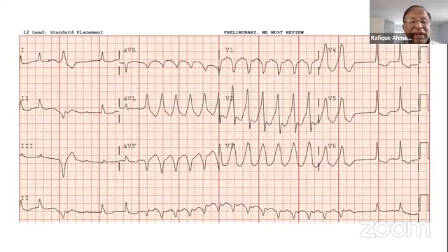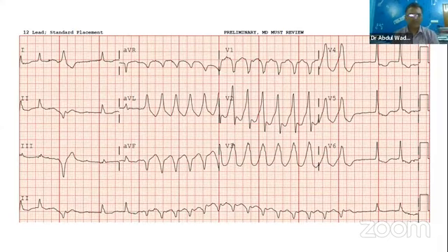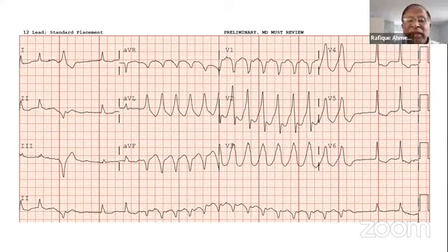The same patient, there was another ECG. Look at this. If I had just lead V3 all over the place, then I would be in trouble. I would say, wow, this looks almost like a sine wave. But even then, there are sharp points. There is a sharp tip. There is a sharp deflection on the downstroke. So if I just had lead V3 on a long rhythm strip, no question about it. But then again, in this one, I have both narrow and wide QRS. So that takes away the metabolic part. Thank you. That was a very good point.